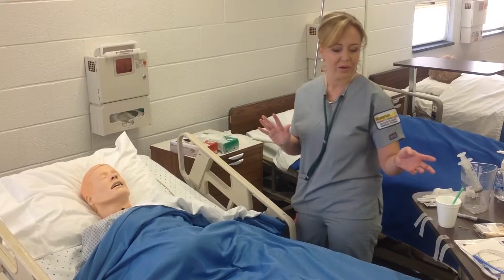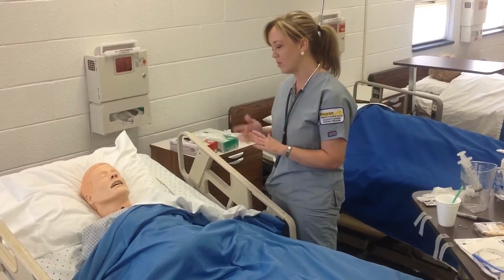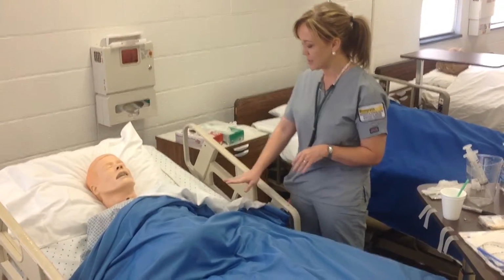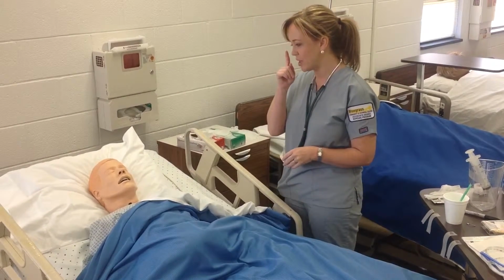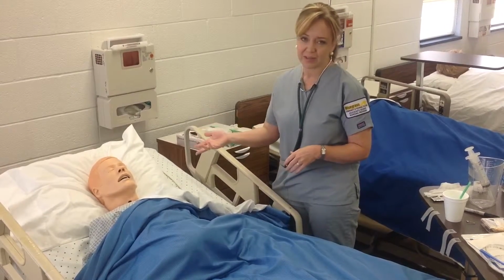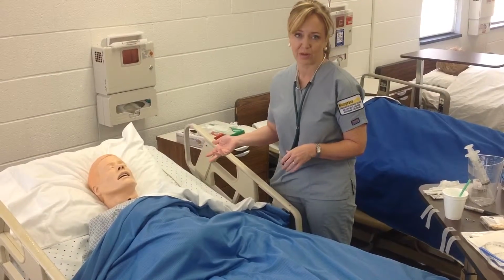At that point, I'm going to give him his water so he can swallow, and the tube will go further down. I do want to assess your abdomen today, and we're going to see which side of your nose you prefer. Can you touch your finger to your nose and tell me which side is clearer? We're going to establish the patency of the nares to put the tube down the side that is more clear.